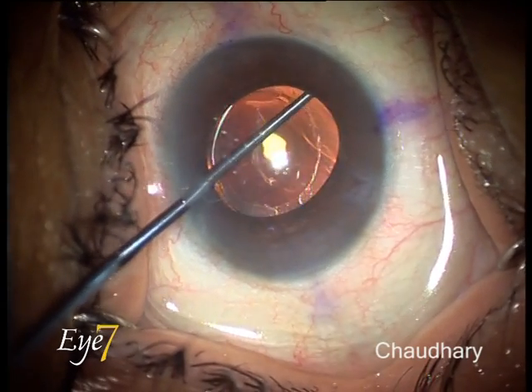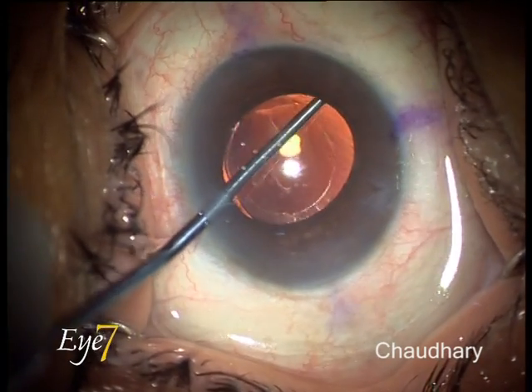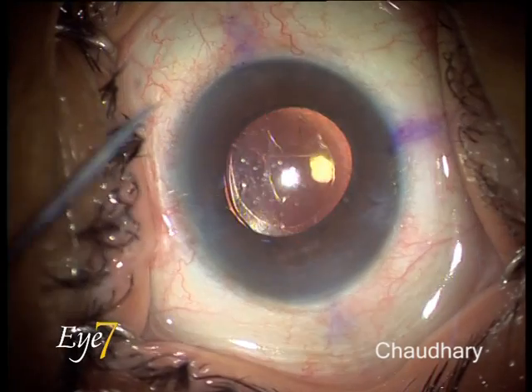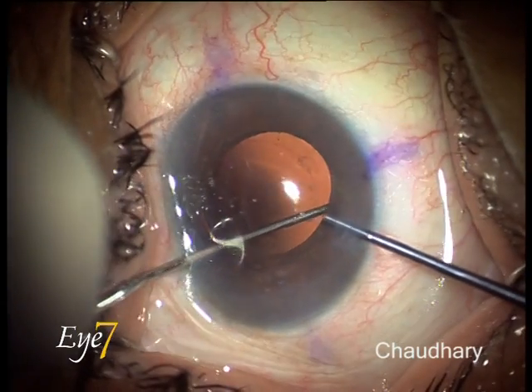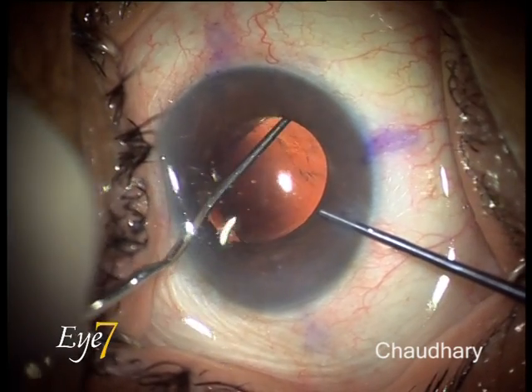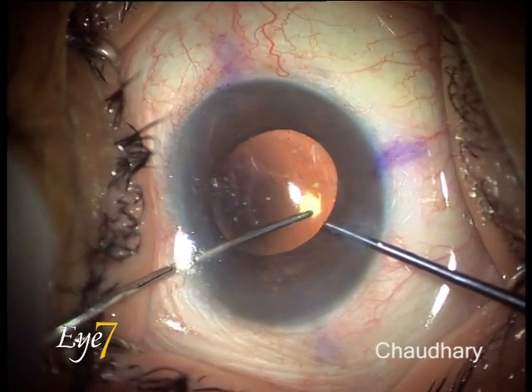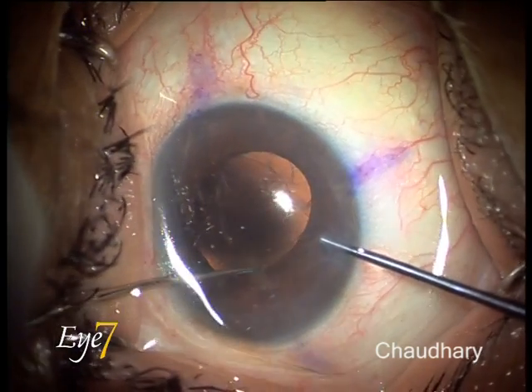Now I am going in with a probe and I am separating the anterior capsule from the lens surface to see whether this move would be sufficient to help me dial the lens. I am trying to dial, but no — I can just move the lens a little bit, but again, no success at dialing.